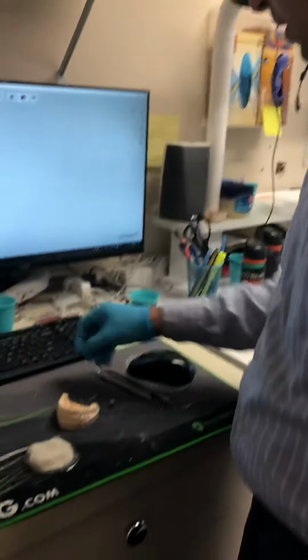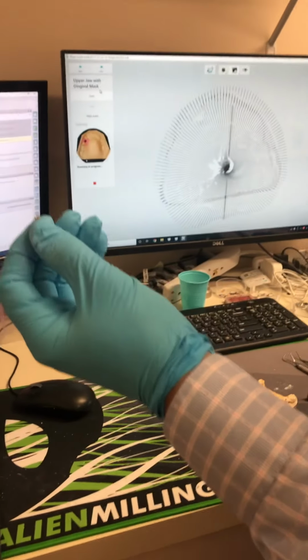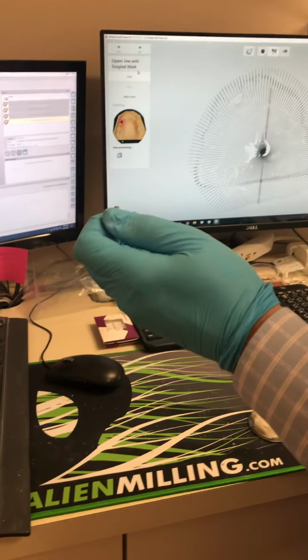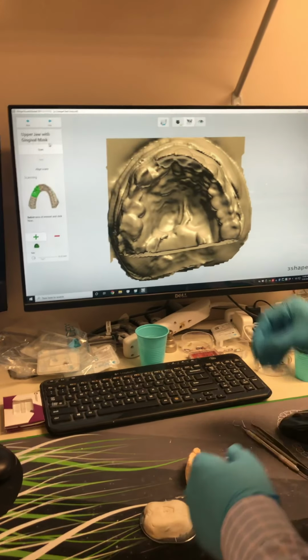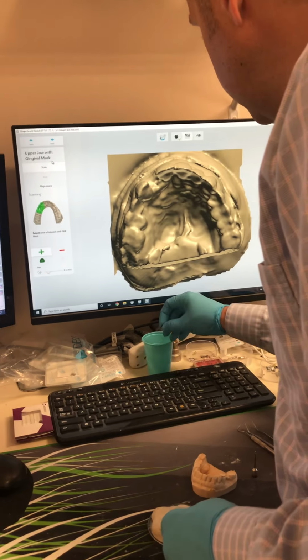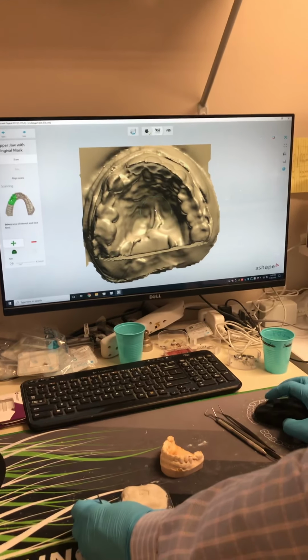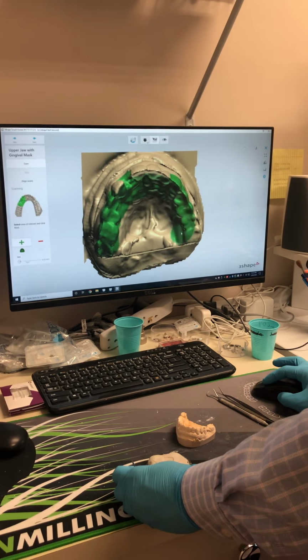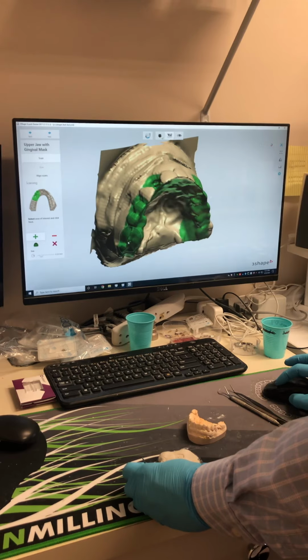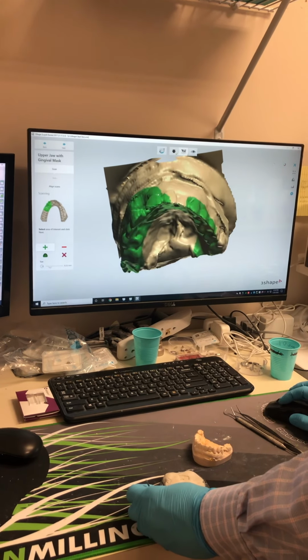Okay. This is the abutment that I'm gonna use in order to cement it in the crown after I make it. So I'm gonna save it on the side. I'm gonna put it in this little cup. Actually here. I'm done for now with it. Again, I have to highlight the area of interest, which is the one that I want the scanner to have a high resolution on.